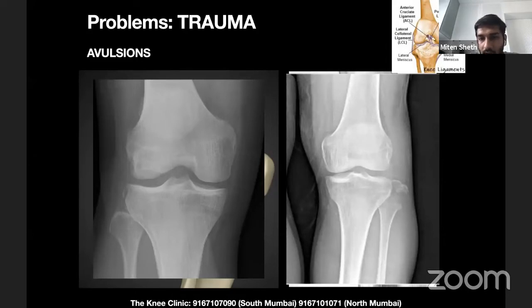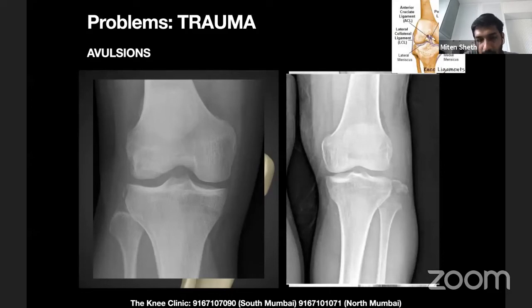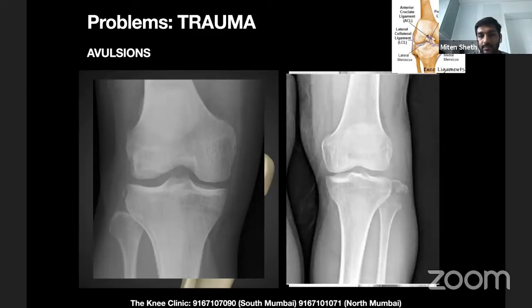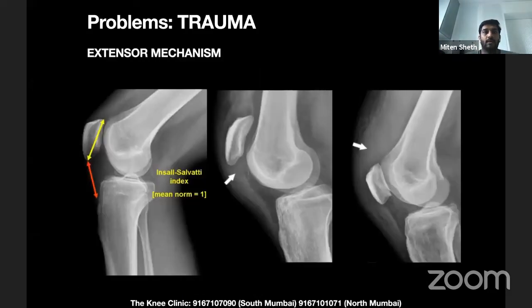There's also a reverse Segond fracture — a chip from the medial tibial plateau — representing a different injury pattern. The key message is that avulsions don't only mean cruciates coming off the tibia centrally. You must look at the rims: the fibular head, the lateral tibial plateau, and the medial tibial plateau for any bone chips.